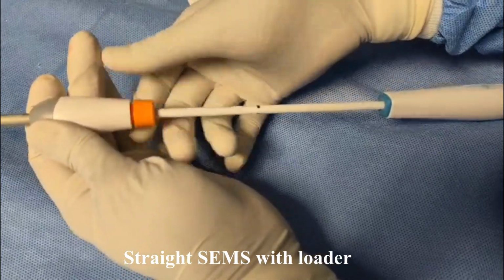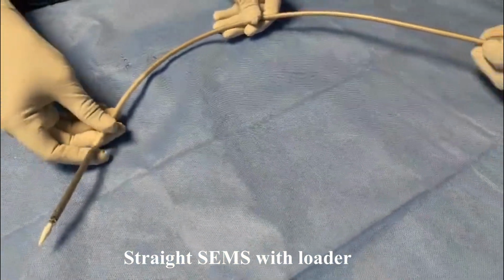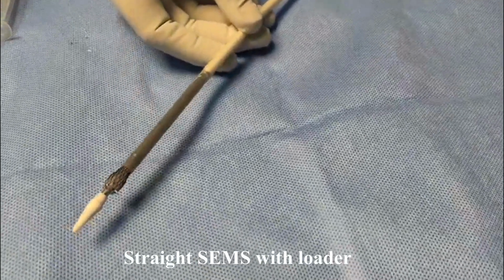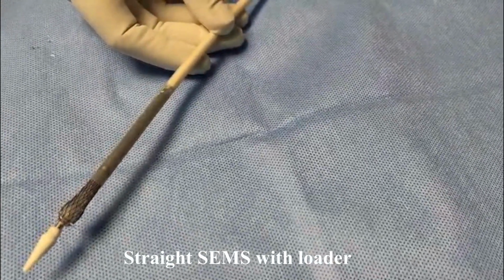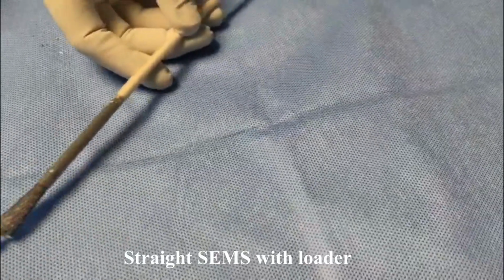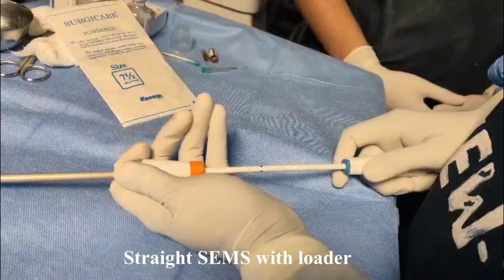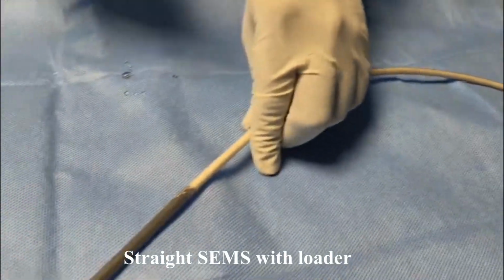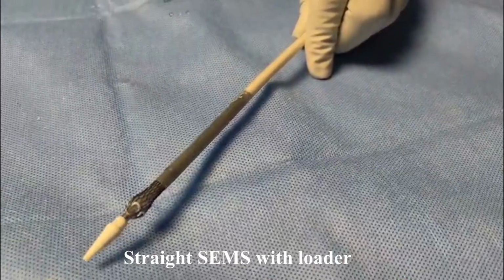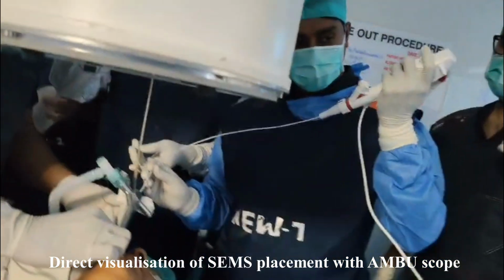This is how a self-expanding metallic stent with a loader looks like. Initially, we unlock the screw and then we test if the loader is working properly or not. As you can see from the video here, as I am pushing the lever, the stent starts opening. And once I know that the stent is now properly functioning, I will be deploying the stent under the presence of a C-arm guidance. Now I will be deploying the self-expanding metallic stent under direct bronchoscopic visualization and C-arm guidance.